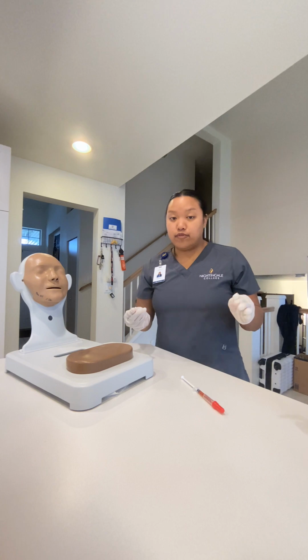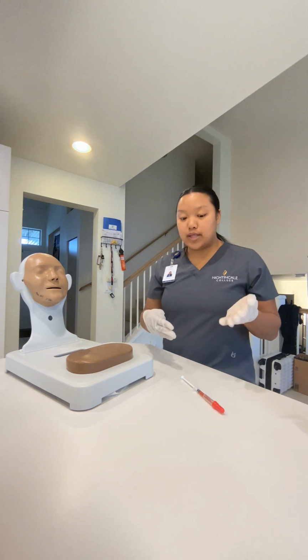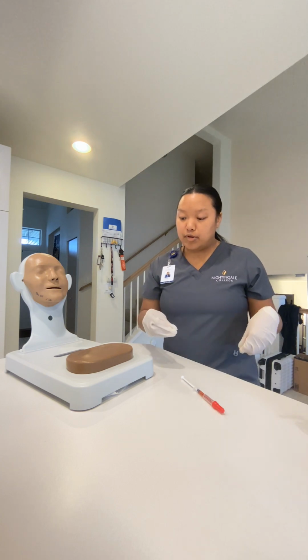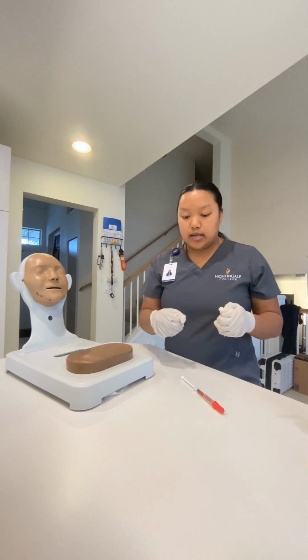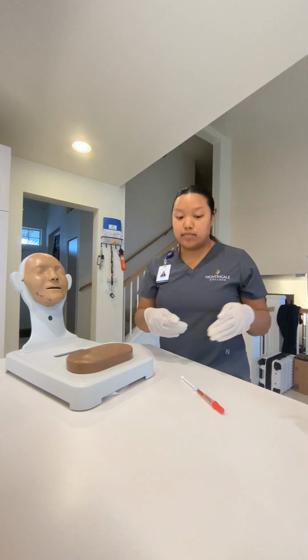So I'm going to go ahead and confirm the 6 rights of medication again. Okay, Ms. Poma, I just want to go over that we're going to give you this subcutaneous injection right on your left abdomen, okay? And it's 1,000 units of heparin, and we're going to do this now, okay? So I already confirmed it 3 times. I just wanted to make sure she knew.